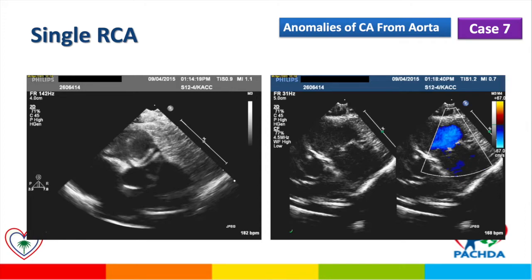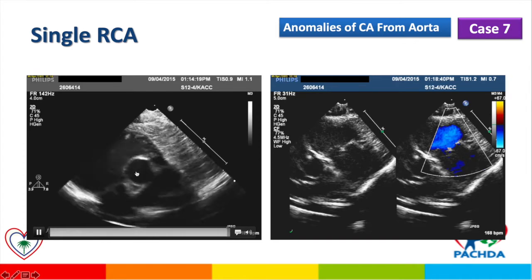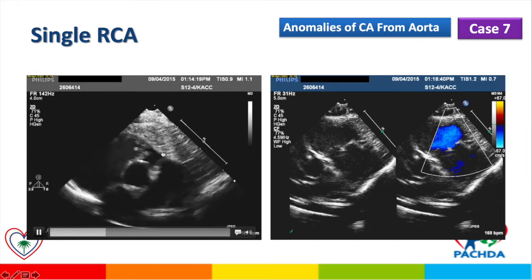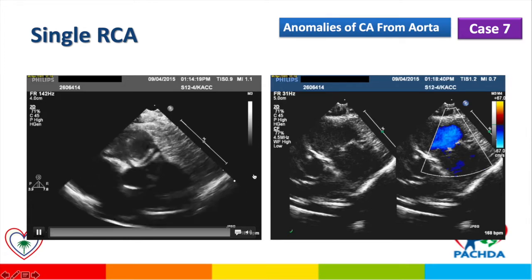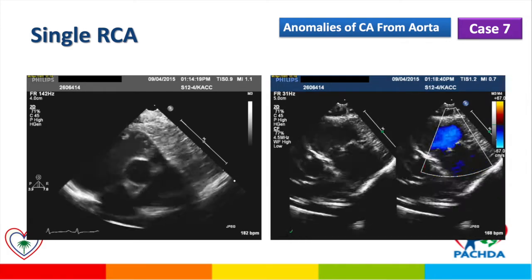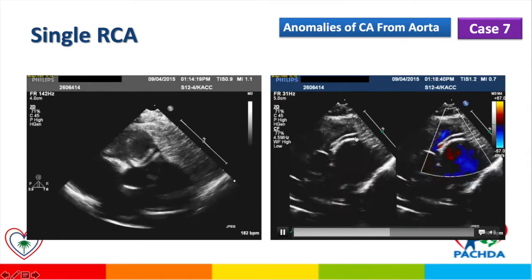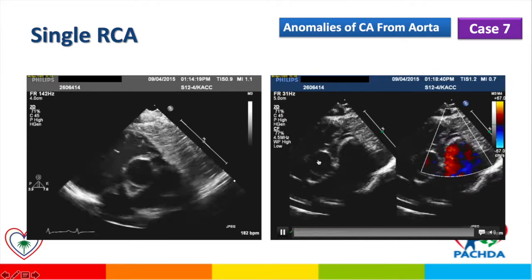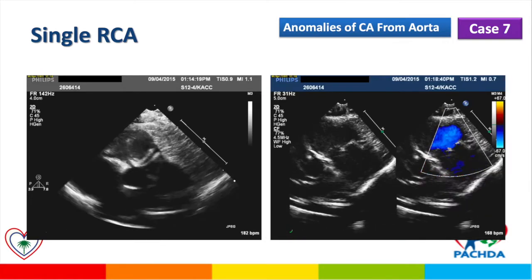An example of a single right coronary artery: this is the right coronary artery, and the left coronary artery is coming out of the right side. With further imaging, you can see that the left main coronary artery is coming out of the right side. So this patient has a single right coronary artery.